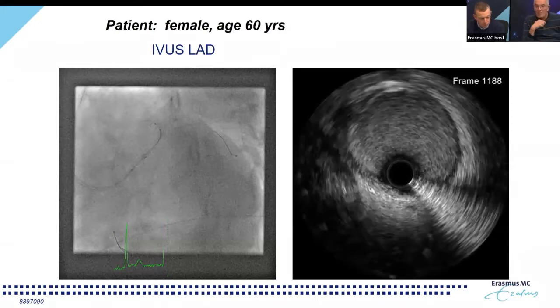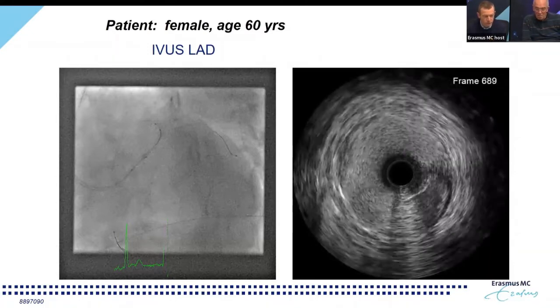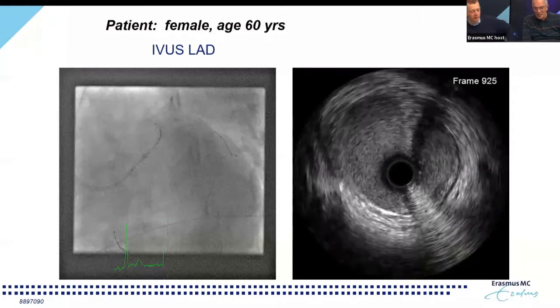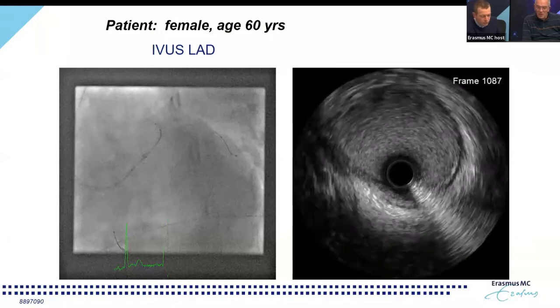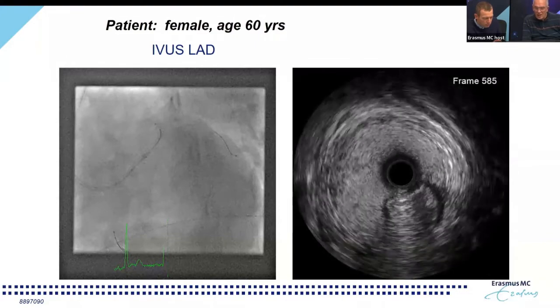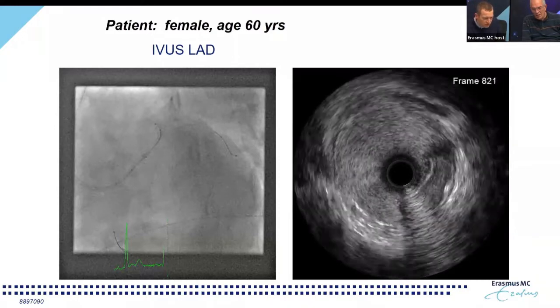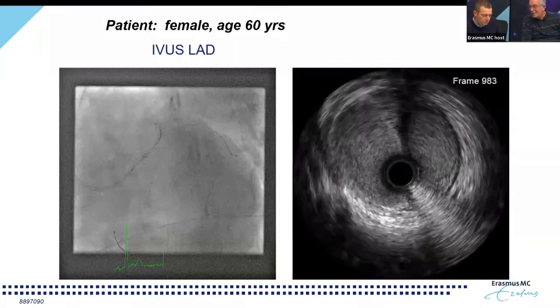But this is also exactly the reason why we always start with 2 slides on the basic components of the normal healthy artery. As long as you always keep that as a basic principle in the back of your mind, you will immediately realize at the point where you start a pullback, in this frame here, poof, you immediately see this is not normal. And this is not a plaque. What you can see here is this fluffy, pushed-away balloon on the outside. That is the true lumen. Flow goes through that, you see?